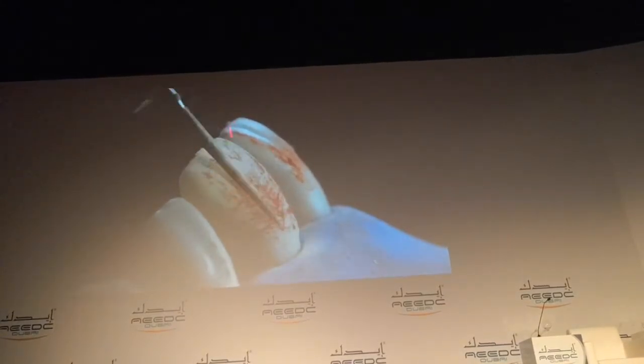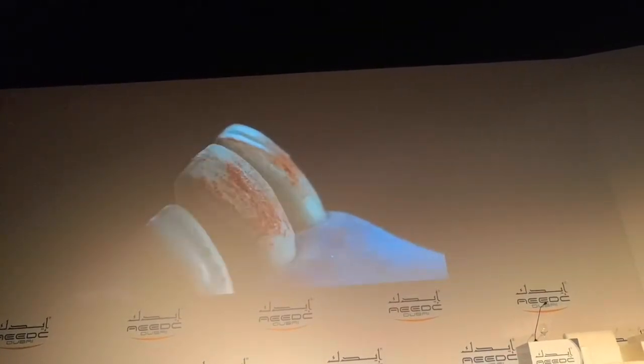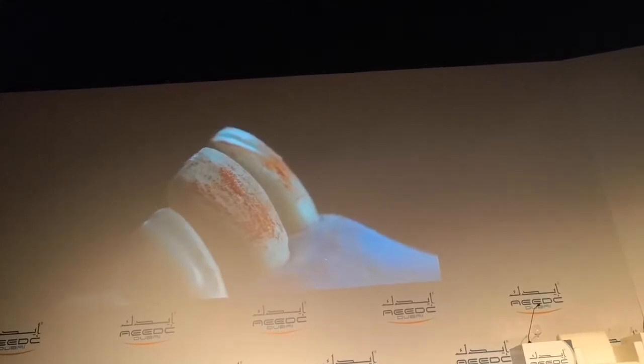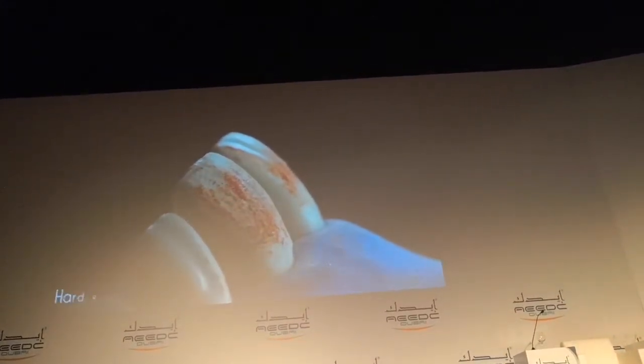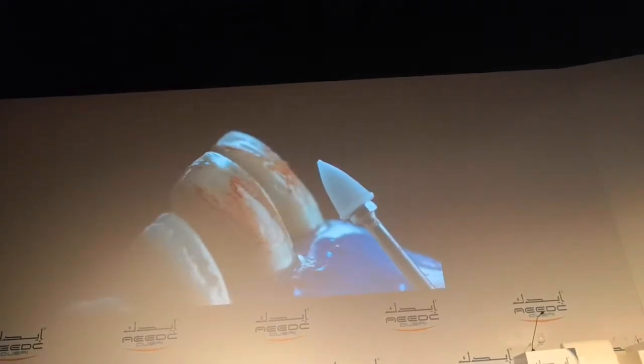You see that every time I work with the articulating paper to see the texture, because when you work on something white, especially under a powerful reflector, you don't see the surface that well. So I use the colors of the articulating paper and I also try to observe the retention of that color when I use the rubber instrument. It means that I am checking the retention of the articulating paper color — if I can smoothen it, it has less retention of color, so I smoothen it and continue.